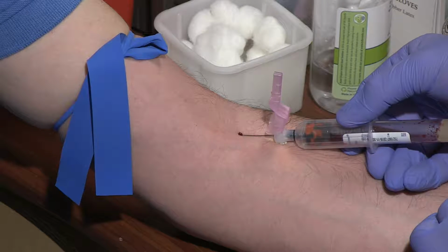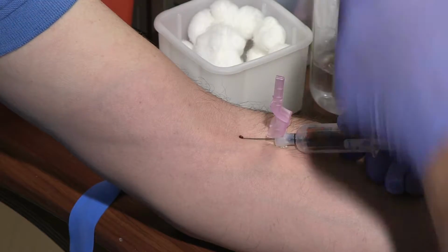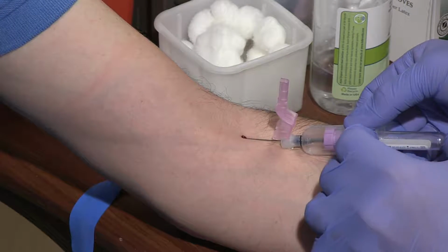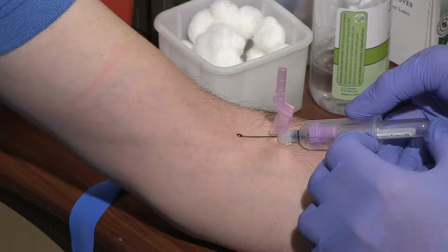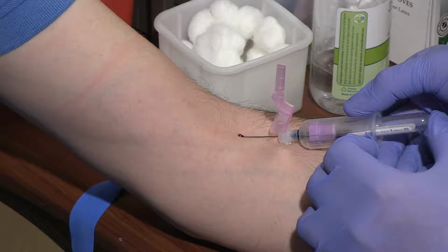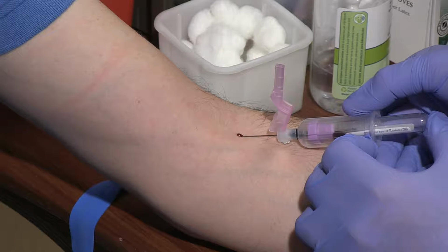If the needle is pulled out of the skin before blood is returned, the lab tube will lose its vacuum and must be discarded. The lab order from the provider for this procedure will require 2 tubes be collected. The medical assistant must demonstrate that he or she knows the correct order in which to collect various types of samples. The medical assistant must release the tourniquet before the first sample tube is filled and definitely before the needle is removed from the vein.